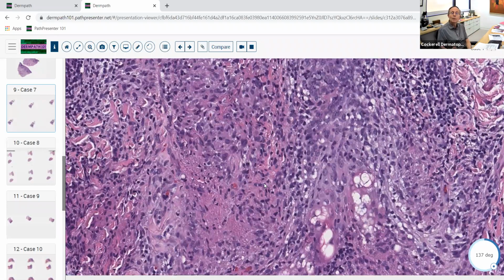Now, you can get suppurative granulomatous dermatitis with rosacea because you can get folliculitis, it ruptures and whatnot. But when you see this pattern, this is the classic pattern that we see with lupus miliaris disseminatus faciei, with just what we call granulomatous rosacea of somebody's face. When you biopsy it and it looks papular and yellowish, you biopsy it and it shows this pattern. So this would be a nice example of granulomatous rosacea.